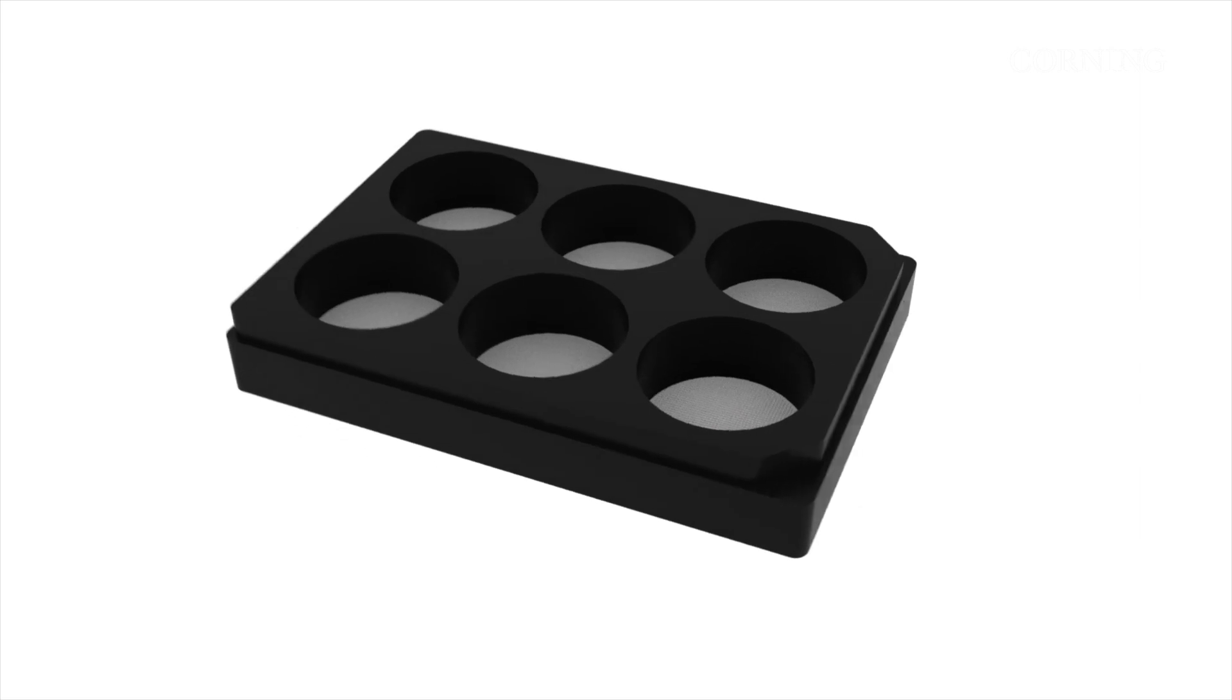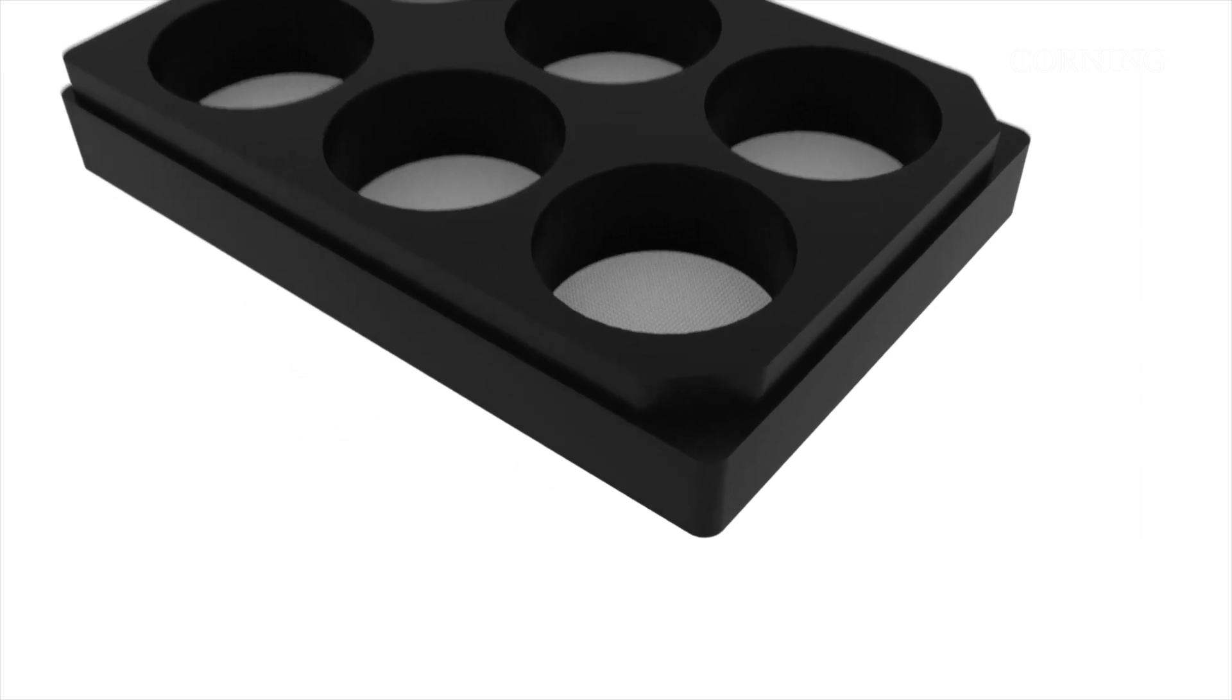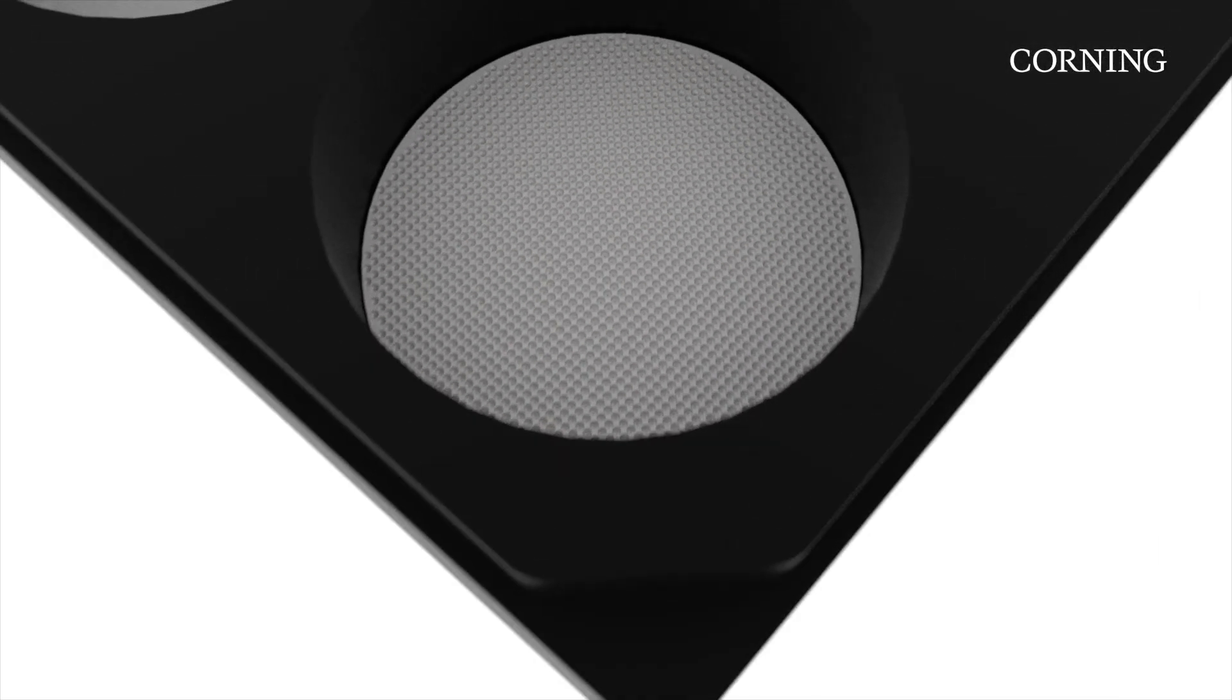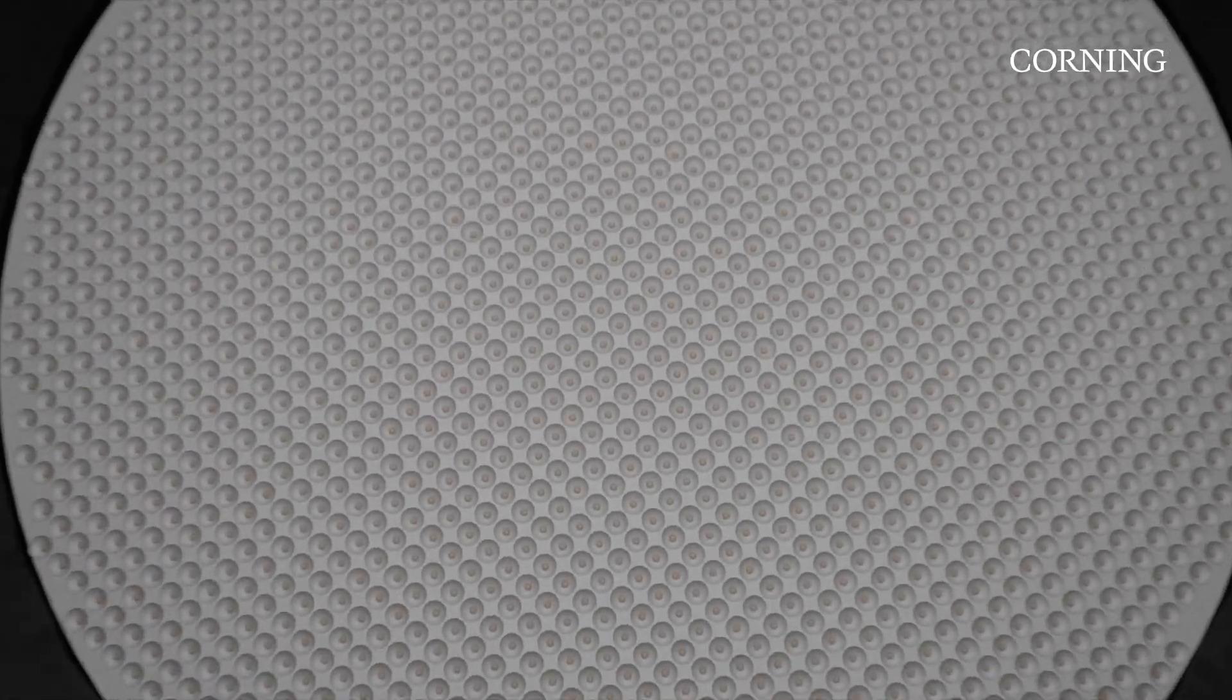Corning Elplasia plates feature micro-cavity technology that simplifies high-volume spheroid production and gives you the ability to generate and culture hundreds to thousands of spheroids per plate under uniform culture conditions.